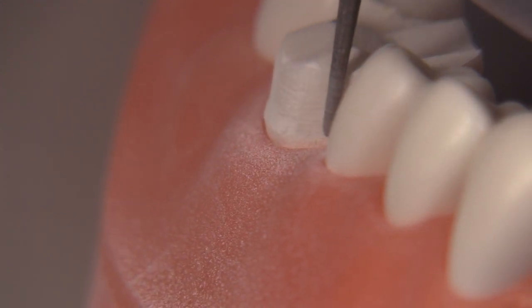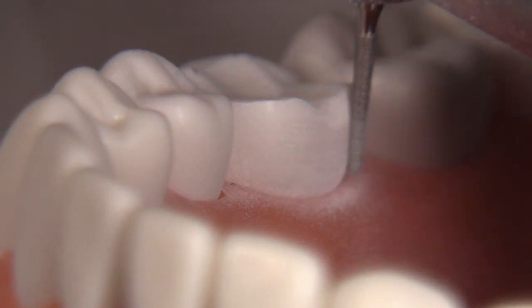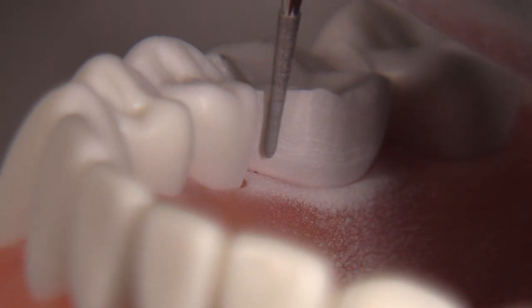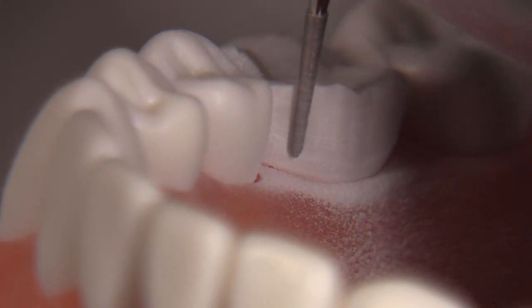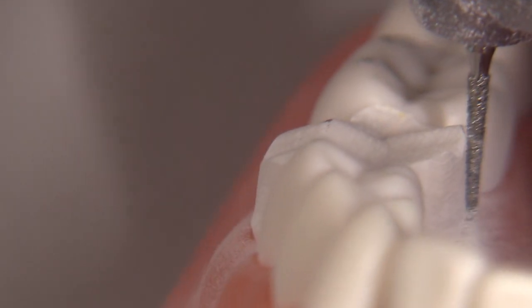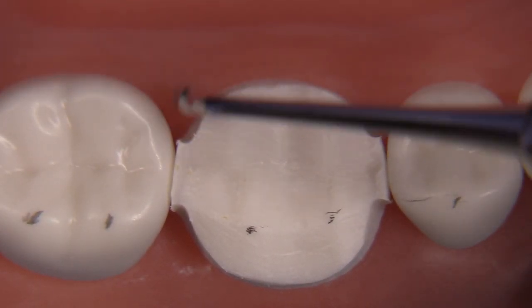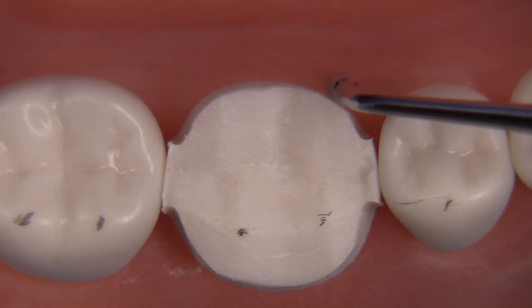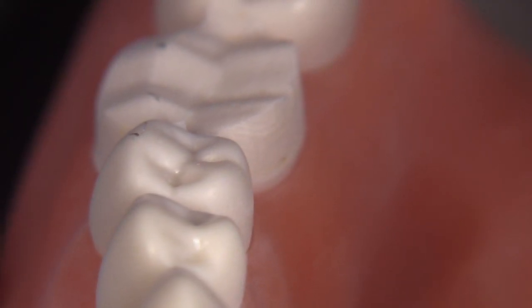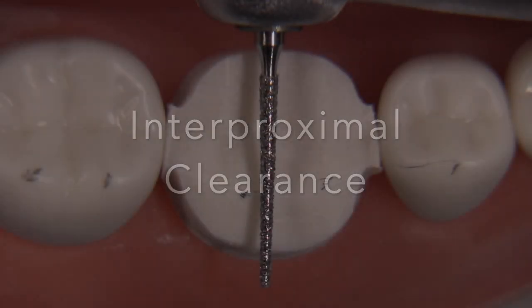It's a good idea to set your finish line location at 0.5 millimeters above the tissue, and then you can always lower it if you need to. If you tend to go subgingival, as many students do, I would suggest going a little higher up. If you've done this step correctly you're going to leave little unprepared sections, which you'll remove in the very next step. I like to keep these as narrow as possible buccolingually.